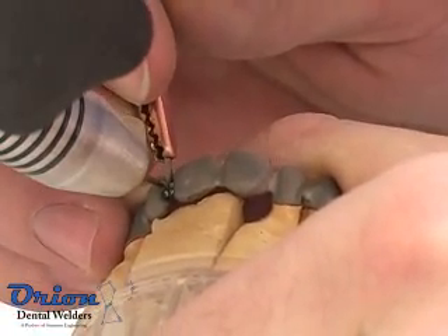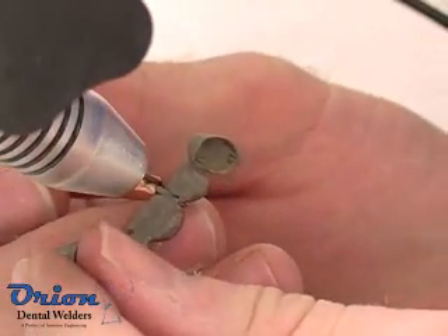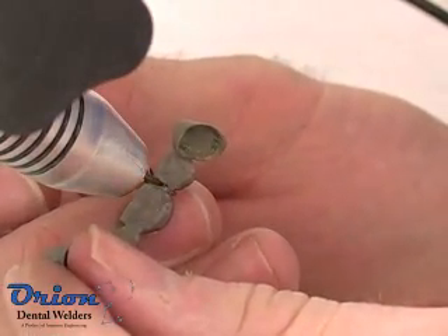The Orion's internal computer takes care of all of the welding details. The operator simply touches the electrode lightly to the metal surface to initiate the welding process.